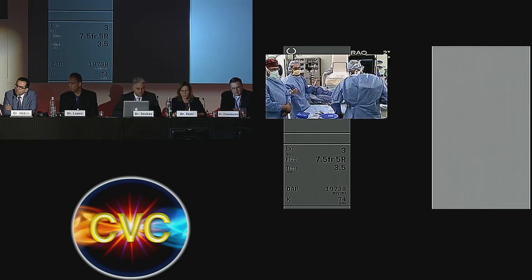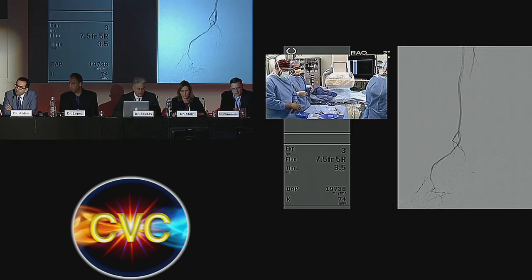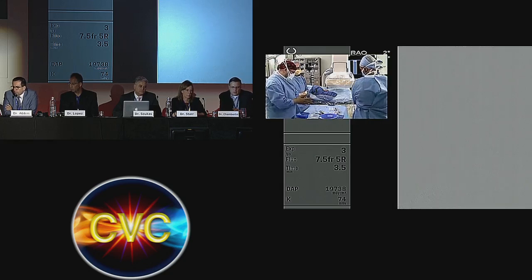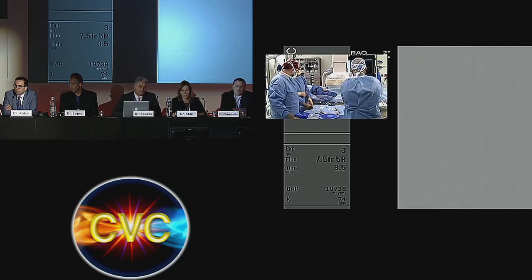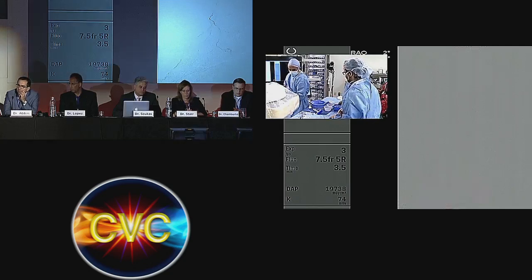The peroneal's there, the posterior tibial, of course, is out. And then next, last but not least, always important, doing a distal runoff to see what's really his main vessels. On physical exam, he has no pulses, clearly due to the tandem effect of all these 50 to 80% stenoses altogether. So I'll be honest, it was actually Luis, who hadn't seen this angio before, who made a point about the necessity or not to deal with tibial disease in somebody that has short distance claudication. So I don't know, Luis, your thoughts here before we ask the panel what their thoughts are.